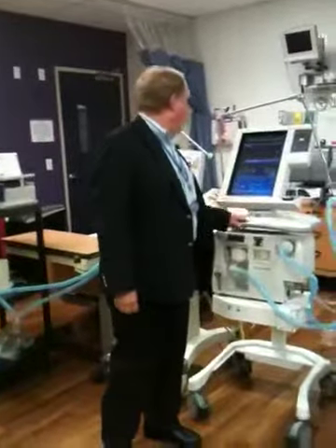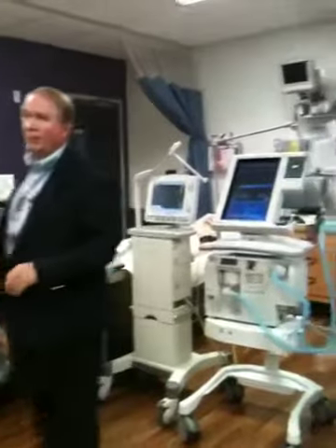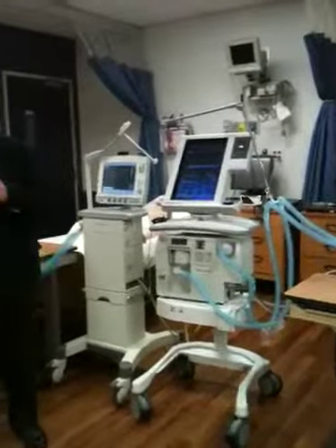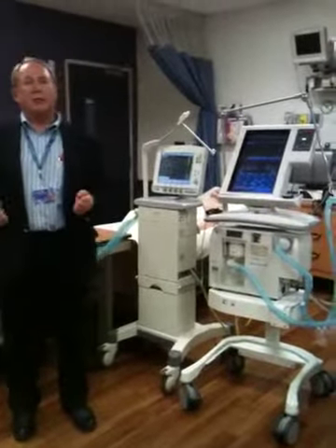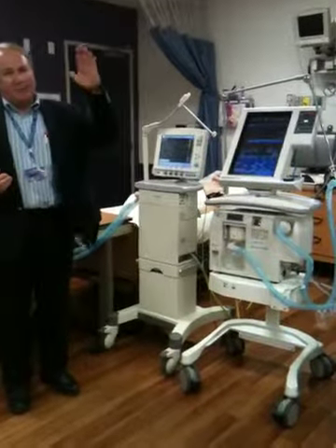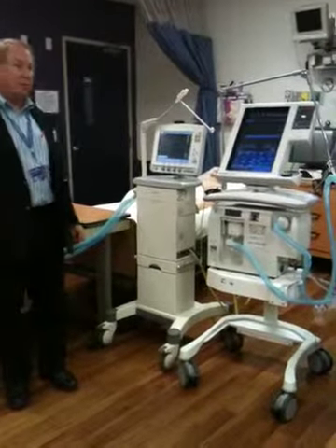This one will also not give me plateau. That one will. The one back over there does not. We have a couple others in the other room that do them as well. Some will calculate, some won't. Galileo does calculate on every breath. The problem is, people question whether it's a true static compliance because it doesn't really do a breath hold. It does a slight pause, which is not really a breath hold as it should be.